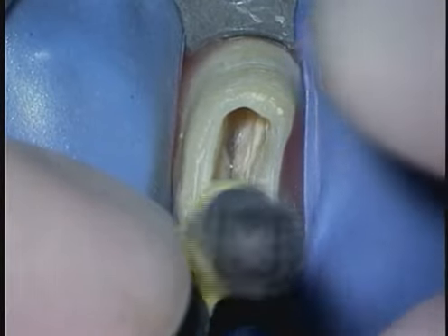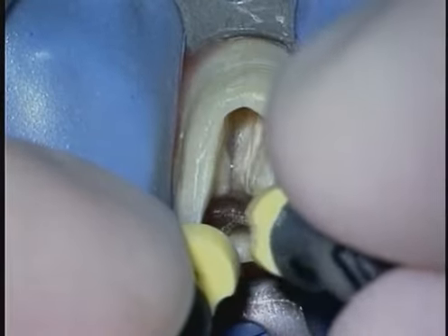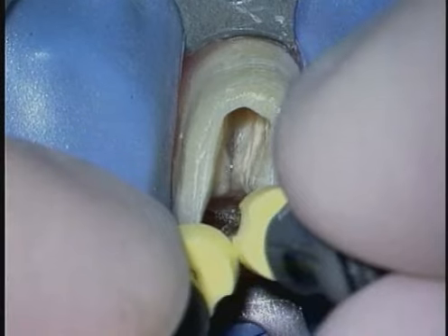It's convenient to insert both instruments, so that when a film is taken, you get information regarding both canals. The post-op film demonstrates the endodontic procedure, conservative shapes in the MB, DB, and palatal systems, and that the bridge has been re-cemented into place.